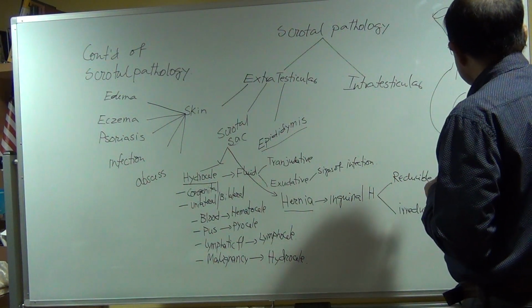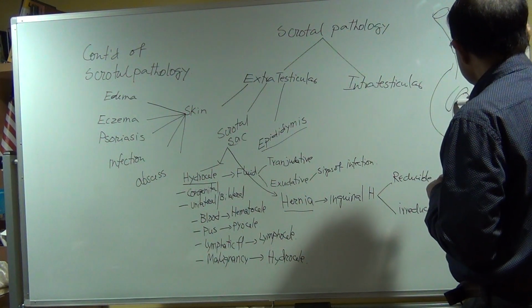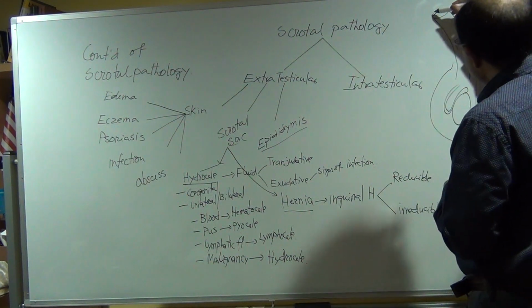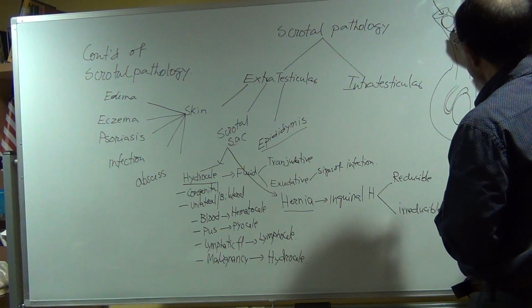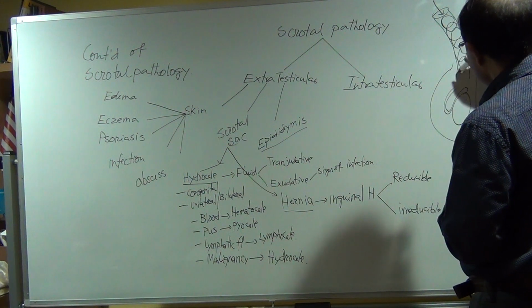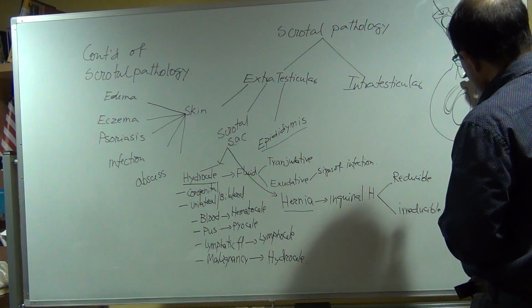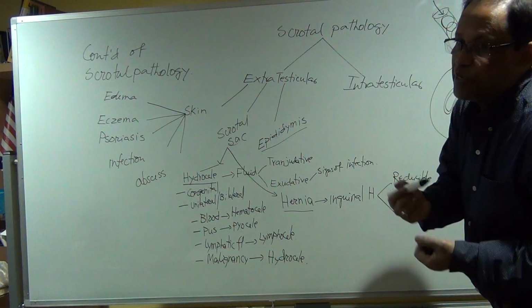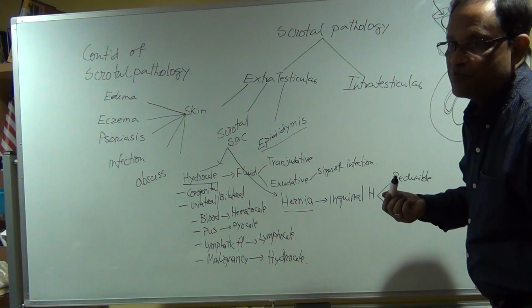This is the testicles and this is the epididymis. So now through this inguinal canal, the fat or the bowels are coming down. When it's coming down, the appearance depends on what it is. If it is the intestine, you will see the peristaltic movement, right?